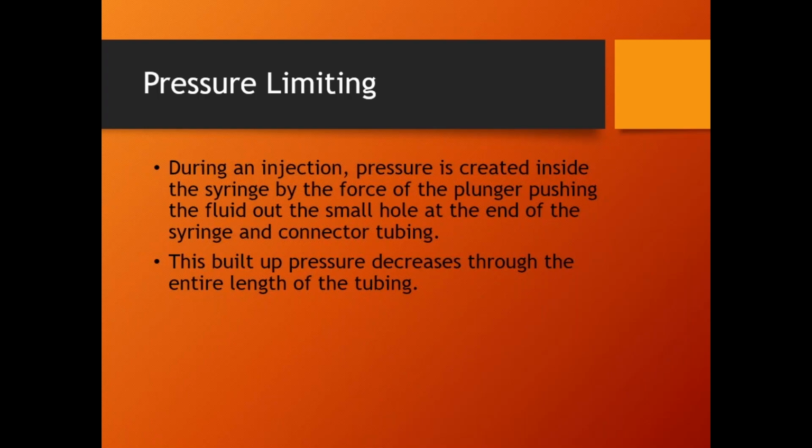There's other little things that do also affect how much pressure gets built up. The viscosity of the fluid: contrast has a little bit of a syrupy texture to it. It's clear. It is very thin, but it's not as thin as water. There is a slight syrupy texture to it. And you have to remember, we're eventually shoving this fluid through an IV needle, which is incredibly thin. So try to shove maple syrup through an IV needle, that would take a lot of force. That would create a lot of pressure. So one of the things is the viscosity of the fluid. The thicker the fluid, the more pressure will get built up.